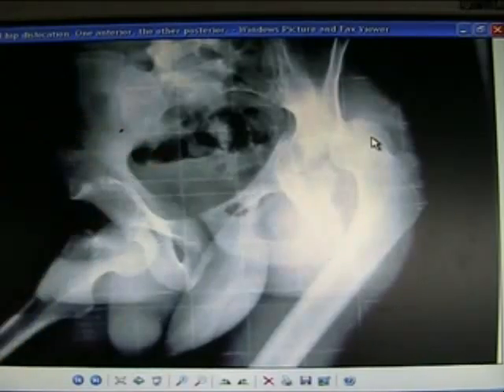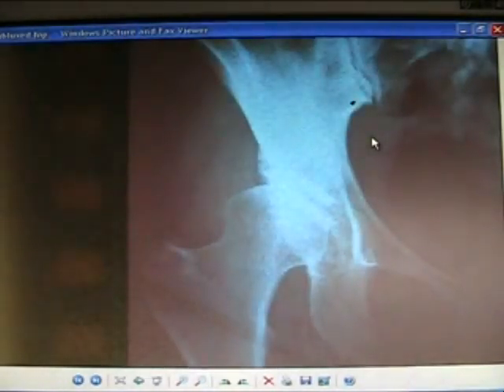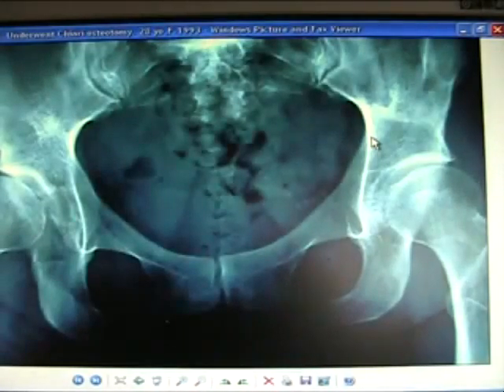Bilateral hip dislocation from trauma. Trying to do a closed reduction from a sporting injury — try to get it in, avoid AVN. Typical posture: internally rotated with a posterior hip dislocation. A dislocated hip implant — have to get it back in, may need to revise the implant.